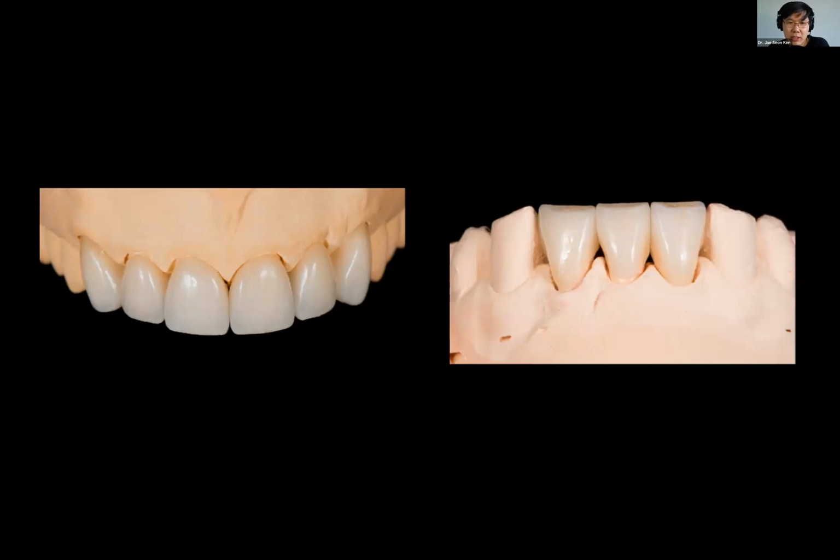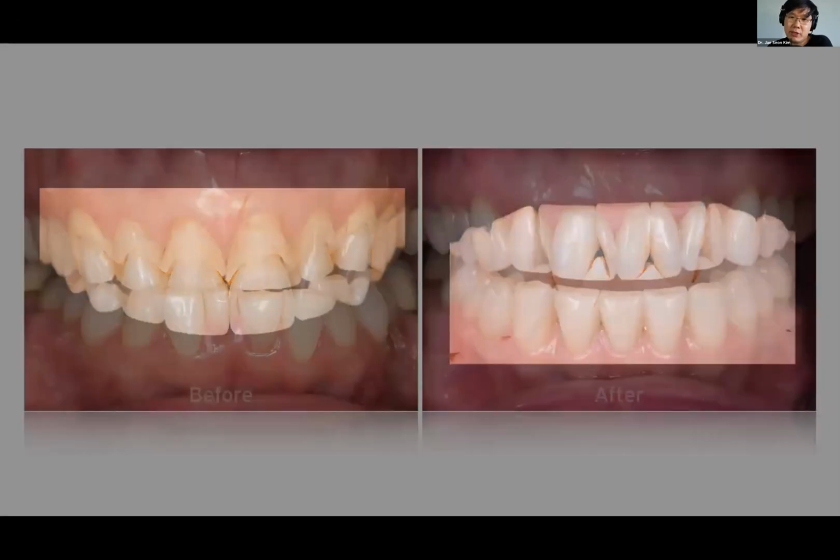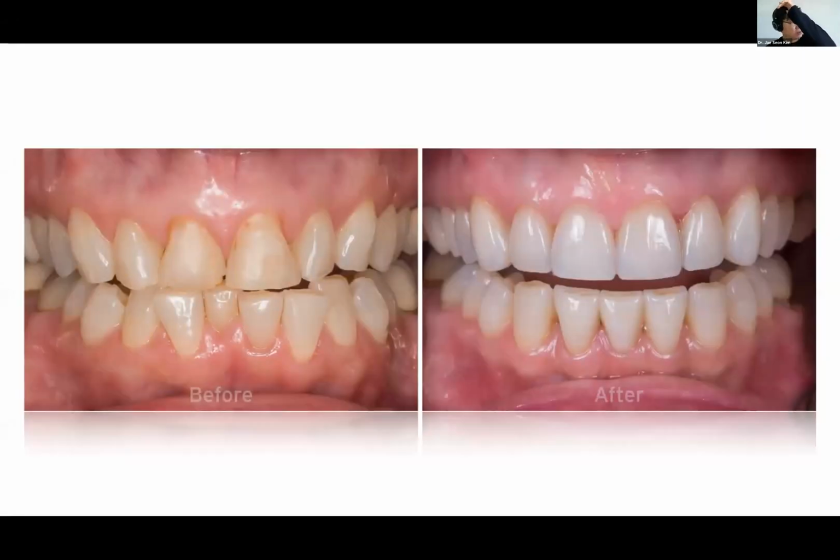And I know monolithic is not as pretty as bi-layered, but the functionality, and redoing restorations, cutting them off and all those things is biologically a very risky procedure for the patient as well. So I like to stay monolithic if possible. And basically I only ask Ben to layer teeth 7, 8, 9, and 10, and everything else is monolithic.